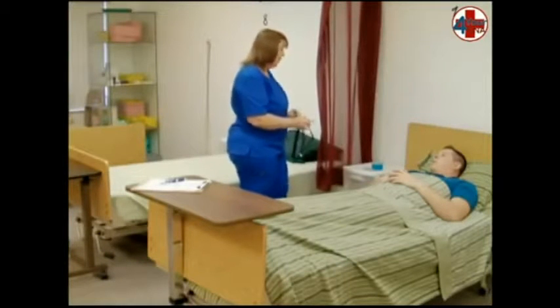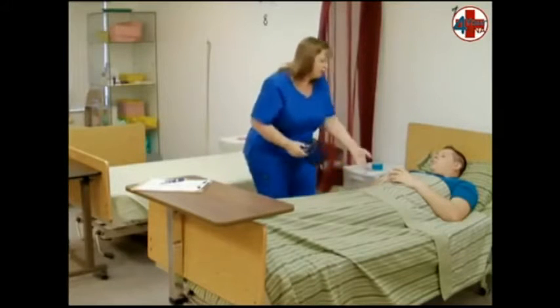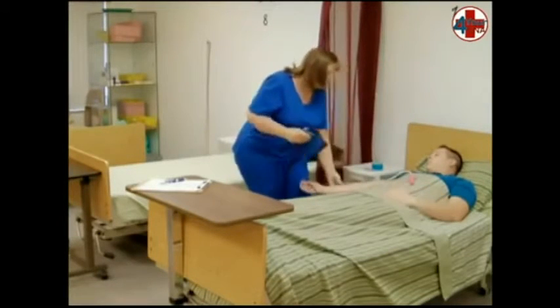Ask the patient which arm he would prefer for blood pressure. Ask him to extend his arm, palm up, and make sure it is supported by the mattress.